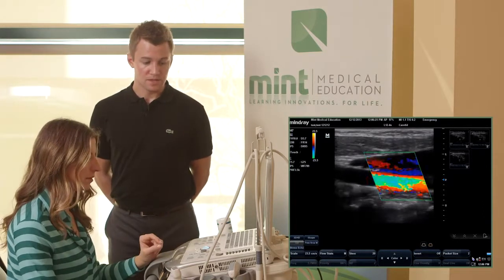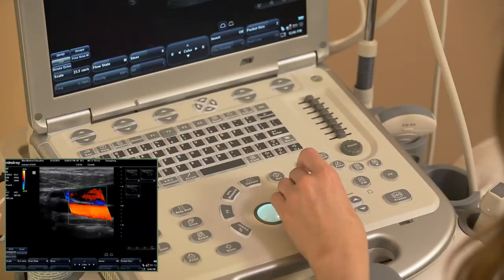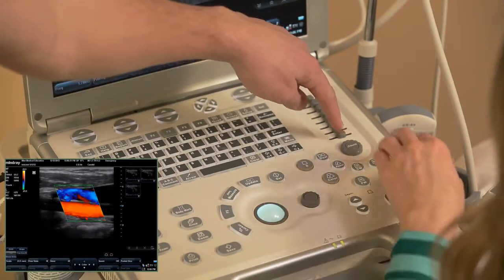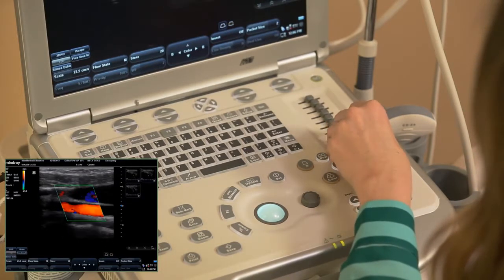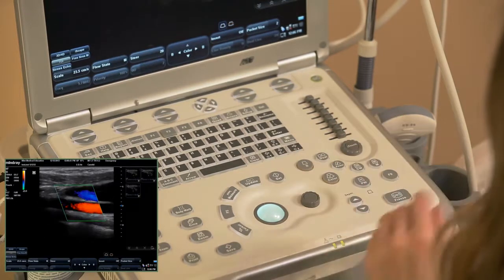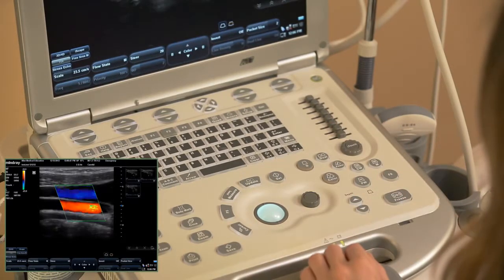Yep. Can we go over? So just like B mode gain, the color gain, or the amount of aliasing, if you will, is controlled by the gain wheel right there. Oh, okay, so this is always gain. It is. No matter what. Whatever mode is on, yeah, correct. So you can see that you can really turn down the color gain and have less aliasing or color outside of your vessel. Yep. And you can also turn it up if you feel like it's too low.